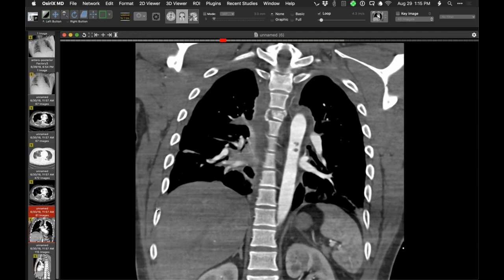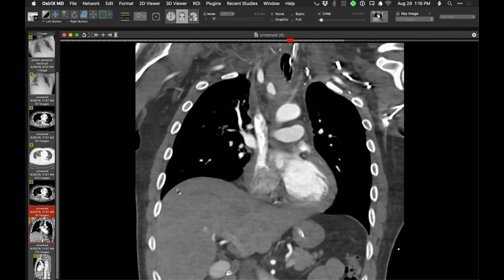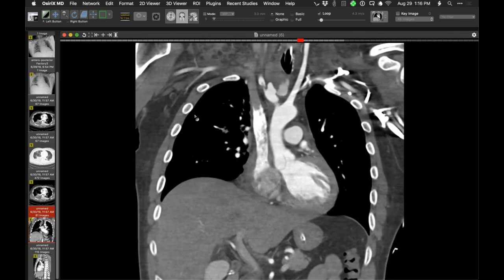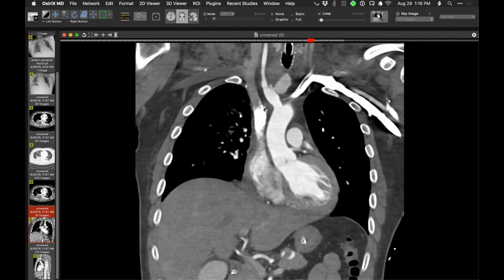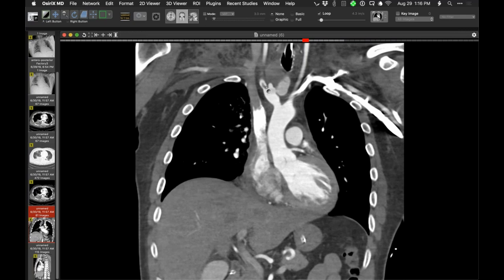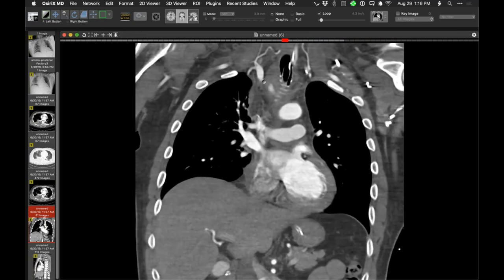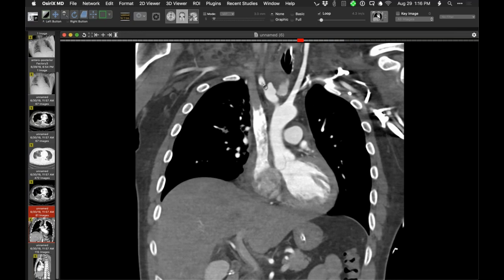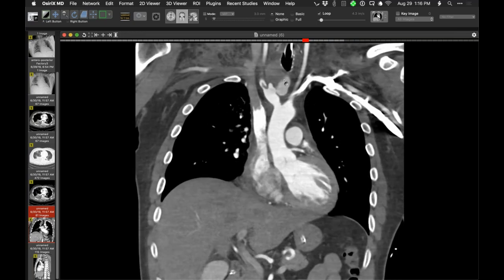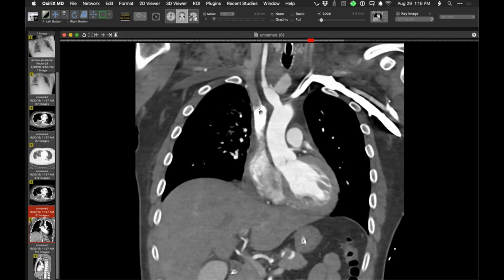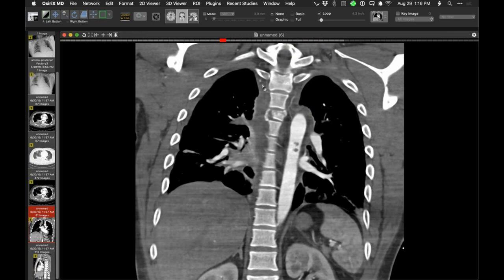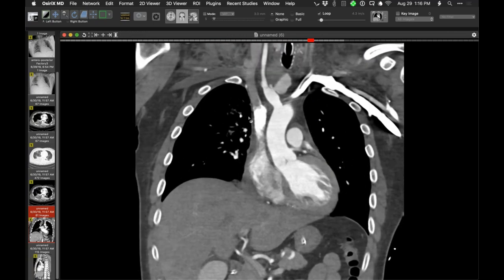What's interesting about this patient is that the biggest injuries — the vascular injuries — are actually up here. Look at this relatively large pseudoaneurysm arising from the right brachiocephalic artery, with abnormality extending up even further. Here's the pseudoaneurysm coming off the right brachiocephalic artery with surrounding hematoma. The aorta has a small injury, but the brachiocephalic vessels have a big injury. This is one of the most extensive brachiocephalic artery abnormalities I've seen in the context of trauma.